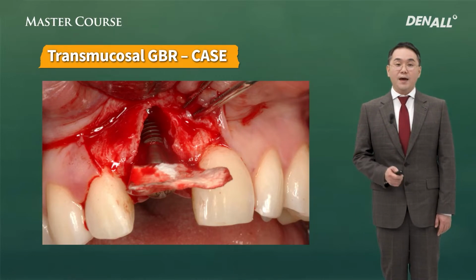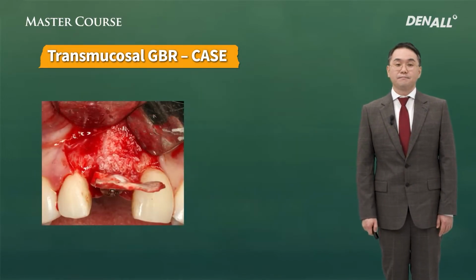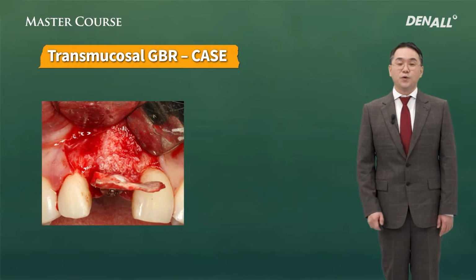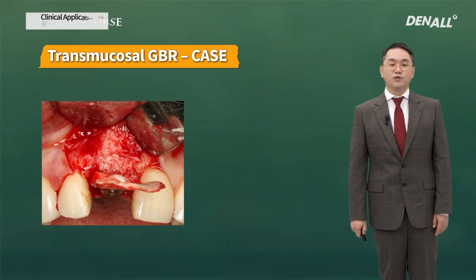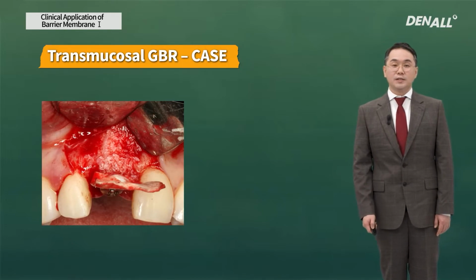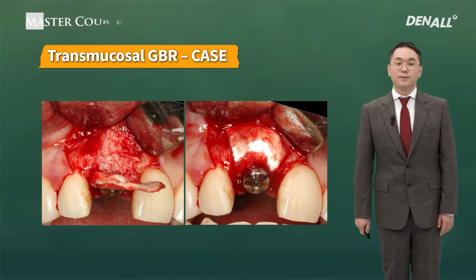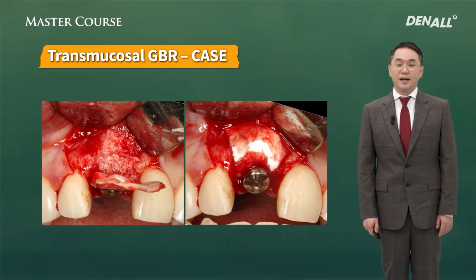Before bone grafting, the membrane is fixed to the implant using the healing abutment. After that, the xenograft fills below the overall defect area. The overall graft site is covered with the collagen membrane. You can see the fixed healing abutment.